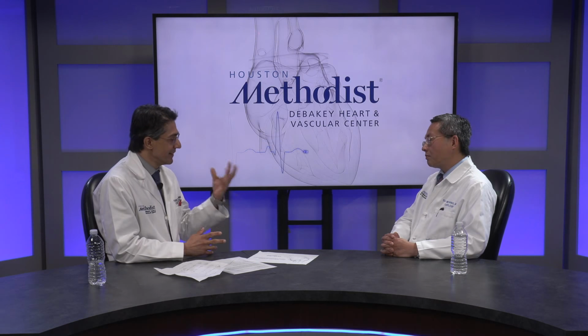Yeah. It seems almost any patient who goes now for a TAVR, the first line test is to get a CT after the echo. Absolutely, absolutely. That'd be fair to say. And I imagine it's because of its incredible ability to see anatomy. Correct, correct. The spatial resolution of cardiac CT is the best we have in any kind of non-invasive imaging technique.